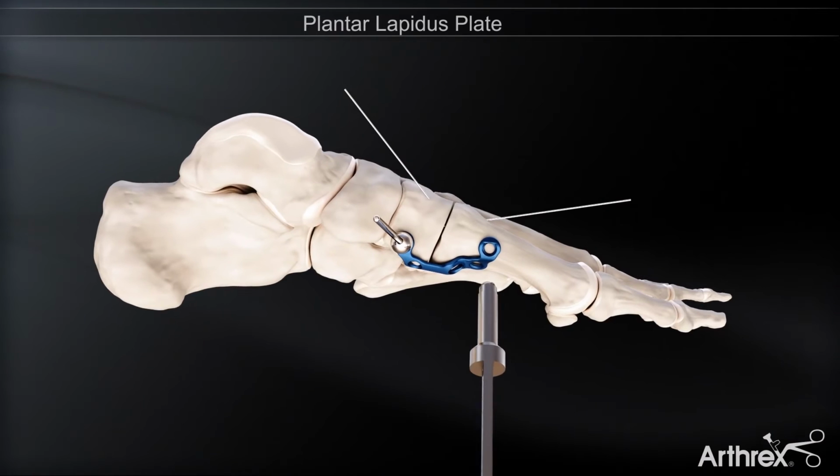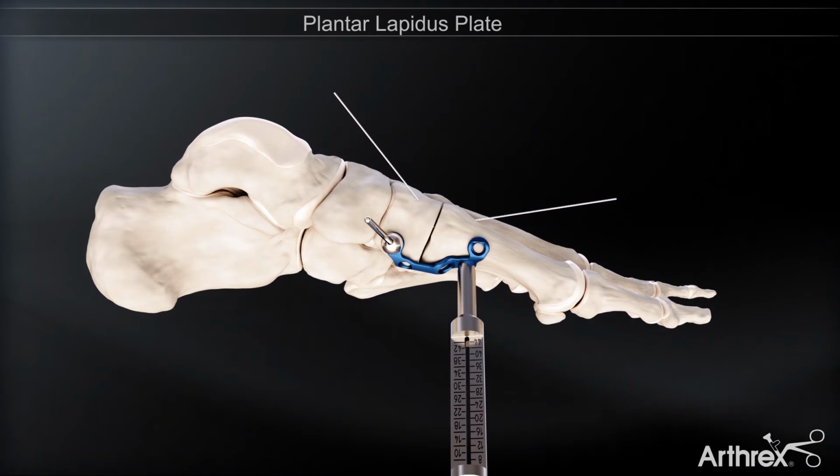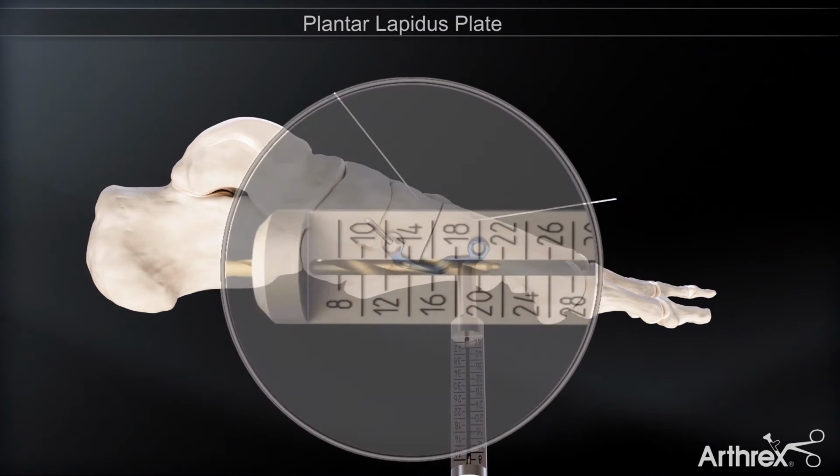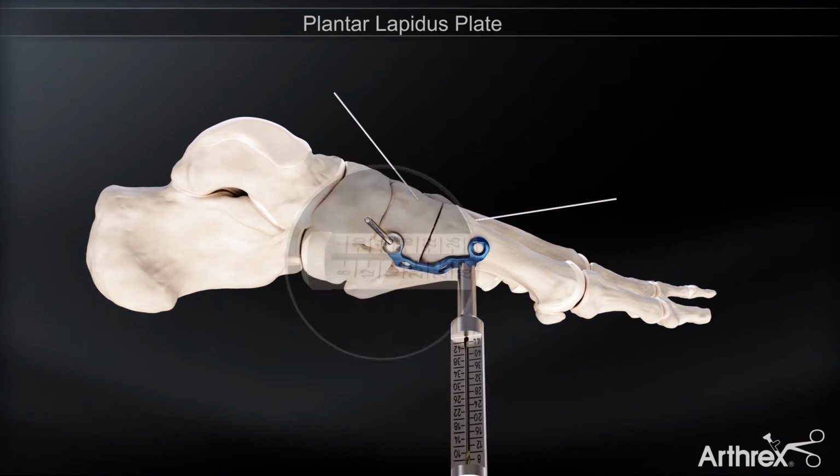Next, the 3.5 mm locking tower is inserted into the plantar distal locking hole, and a 2.5 mm drill bit is utilized to drill through both cortices. The correct screw length can be noted from the laser line on the 2.5 mm drill, corresponding with the markings on the 3.5 mm locking tower.